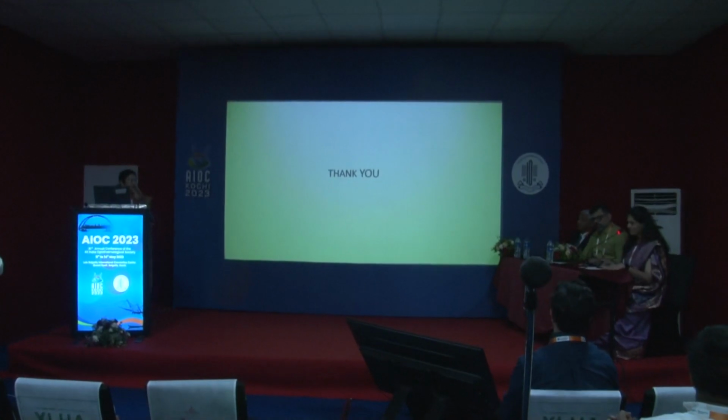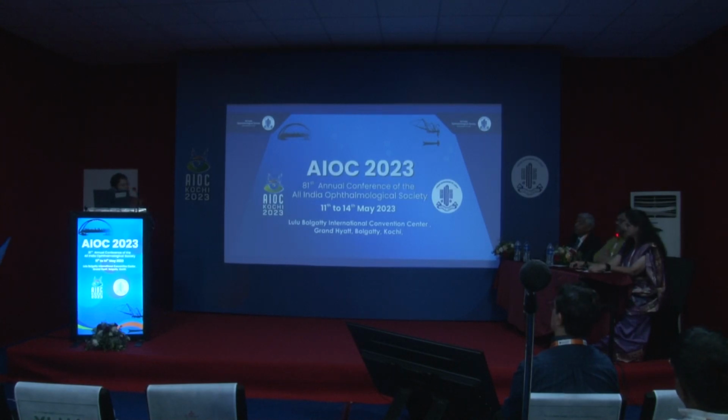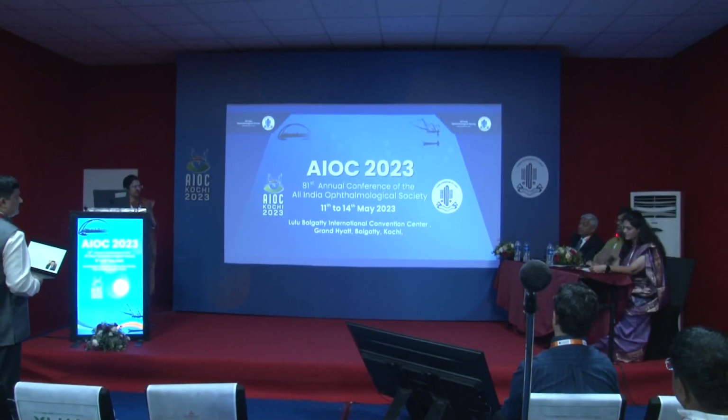Thank you, doctor. I have a couple of questions. One is, I wanted to know where do you access this Kane formula? It's there as an online calculator. As far as I know, it is not available in any of the biometers, but it is there online. Similar to the ASCRS calculator, we have it online. I just wanted to make that point.